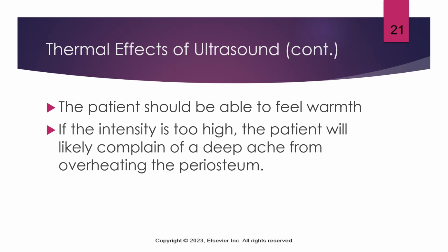Also, you have to be very, very cautious and careful. If that intensity is too high, your patient may complain of a deep ache from overheating of the periosteum.